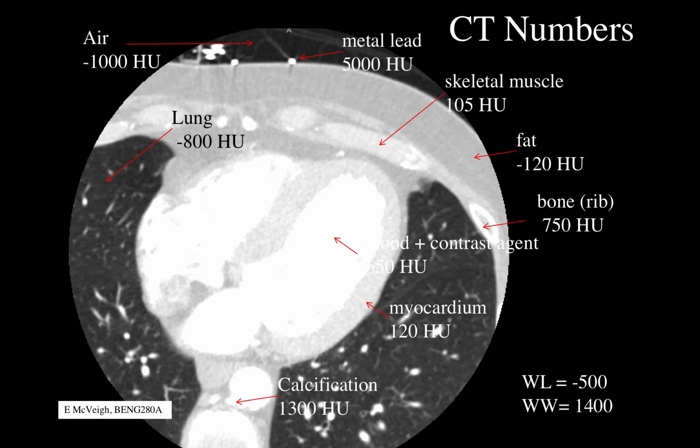Yeah. When you look at calcification, it's not going to be uniformly calcified, right? So that number is going to decrease then, would it? Because the X-ray hits it such that you would get some other calcification. It depends on its shape and its size and things like that. But if your spatial resolution is sufficient, what we're talking about here is whether you can estimate the Hounsfield unit or the mu value, because you can map it back to an actual mu value for each position using that calibration equation.